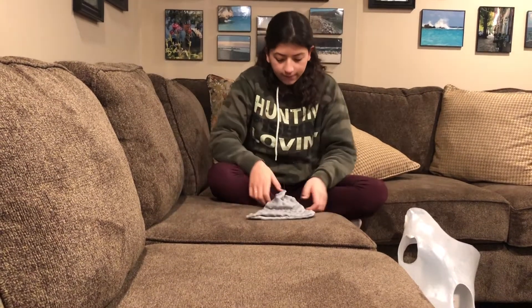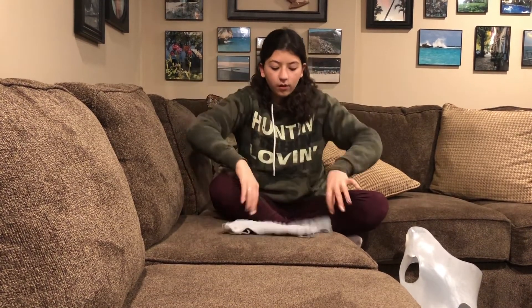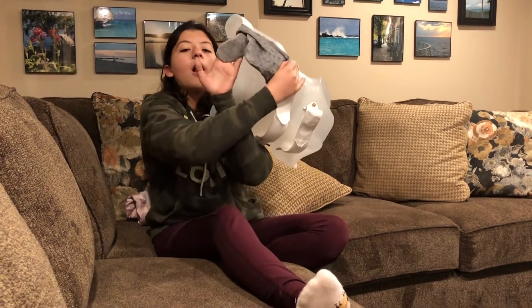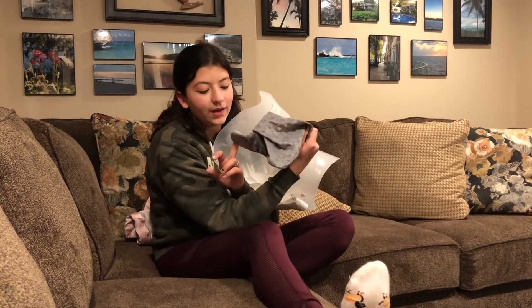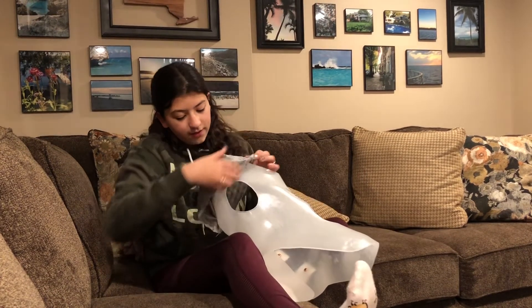This is the final product. It looks a little weird, but now we are going to try it. We had some technical difficulties putting this on, but we got it on before the video — I didn't want you guys to watch me struggle. Anyways, now we're just going to put on the rest of the brace.